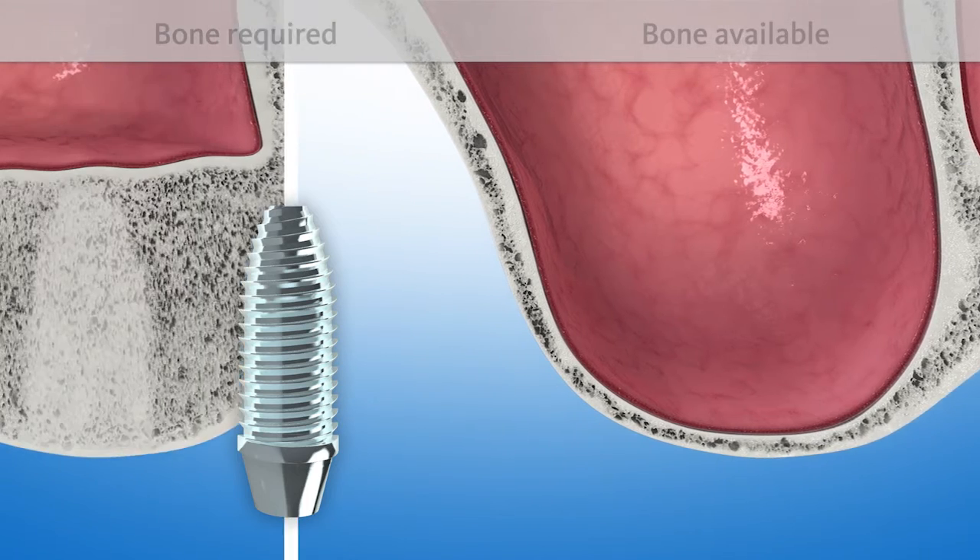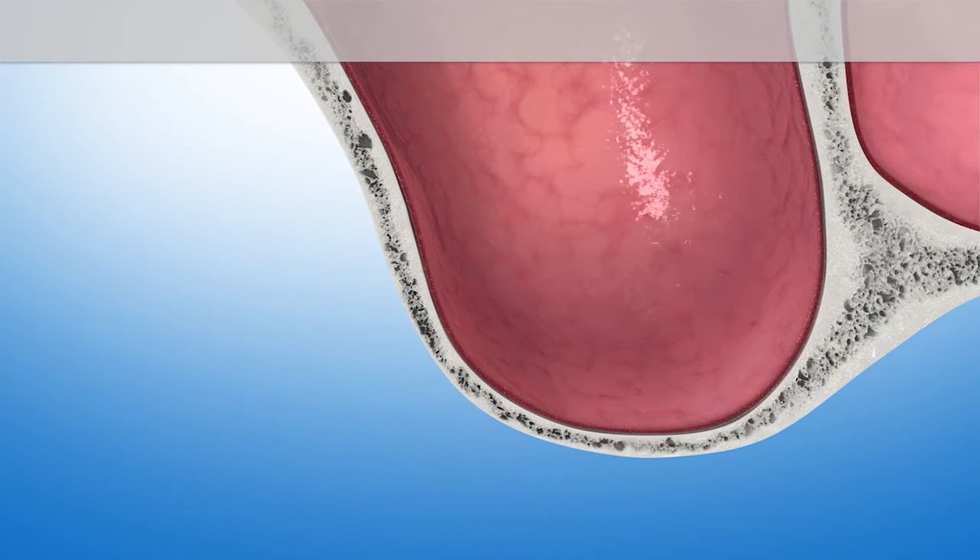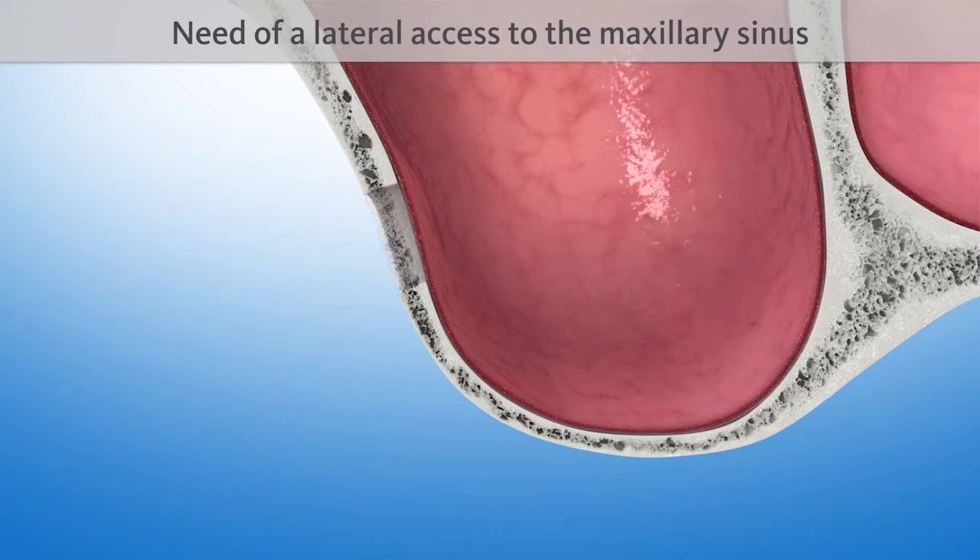For a successful implantation, considerably more bone is required. To build up this missing bone, first a lateral opening to access the maxillary sinus is required.